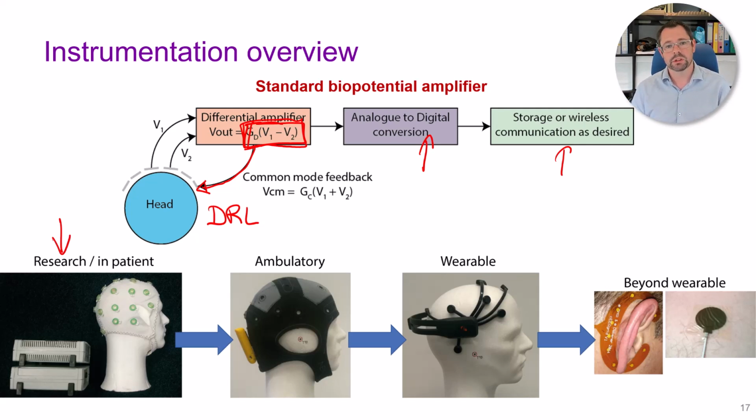It might be that you want to be doing EEG and eye tracking, or EEG and ECG, or EEG and something else. A nice physically big unit means you can connect all of those different wires into the same device. They often have auxiliary inputs. And if you're not space constrained, it can be very useful to have a large inpatient sized unit.